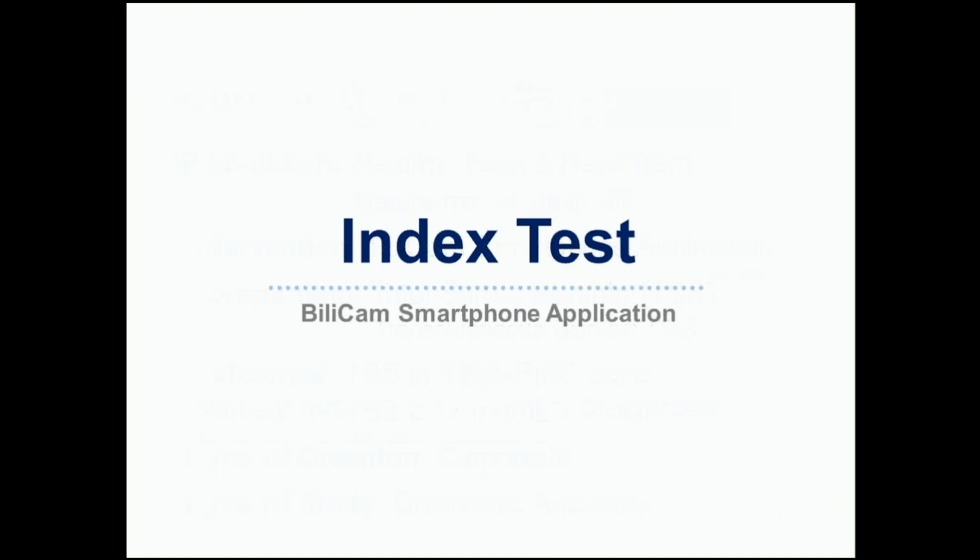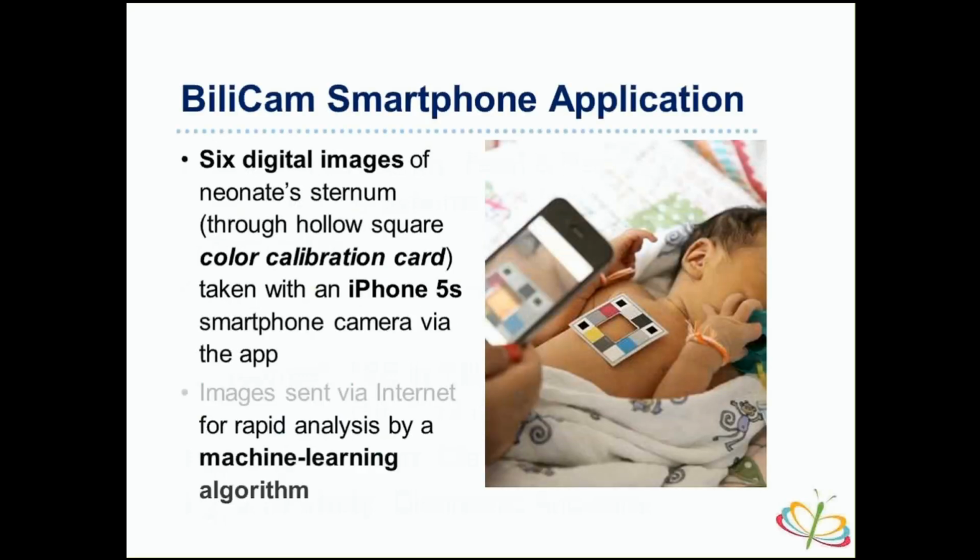Now we're going to talk about the index test, which is, again, this BiliCam smartphone application. The main concept, and you have an example of the cards that were used, are these color calibration cards that were used as part of this study.